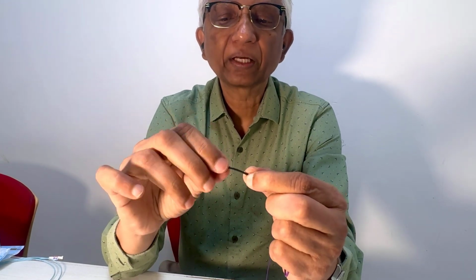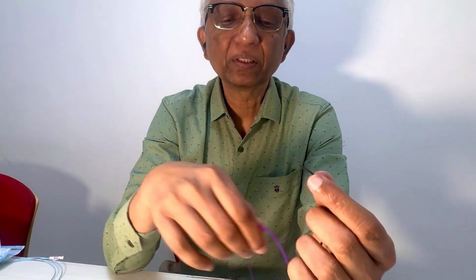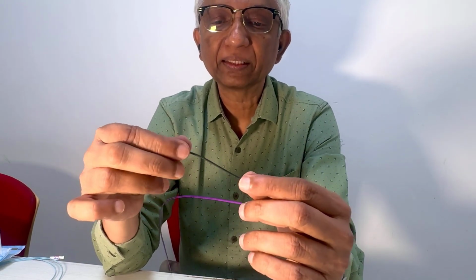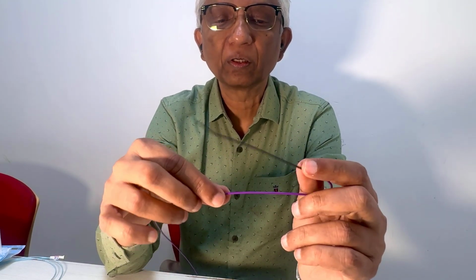See, can you get this? It gets knotted. You try to open this, it doesn't open. You end up breaking this into bits and pieces like this. Can you see that? It's an absolute disaster. It's very, very challenging to take these bits out. So when you're working with these ultra soft tip catheters, always make sure you don't knot it. Always make sure you do not knot it, right?